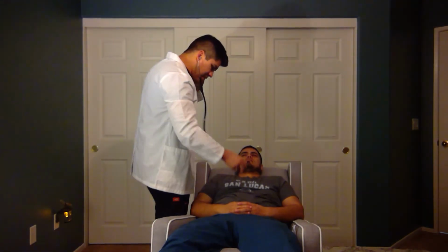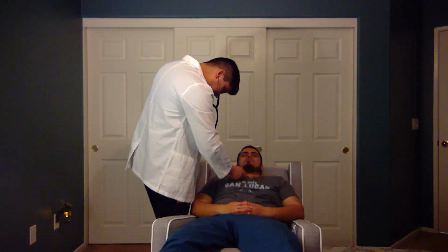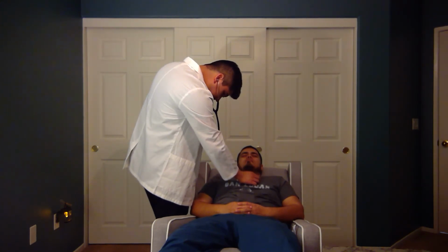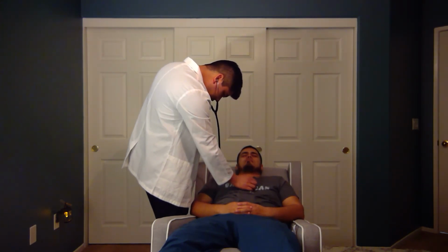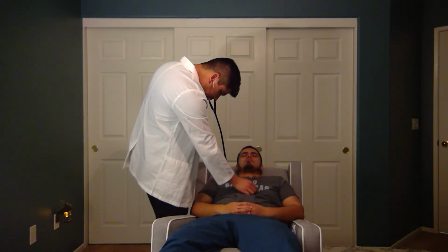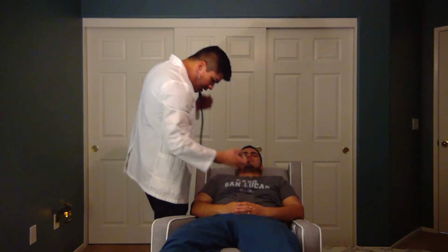So I'm going to ask the patient, can you please inhale and take a deep breath? Again. Again. Okay, I do not hear any splitting of the S2.